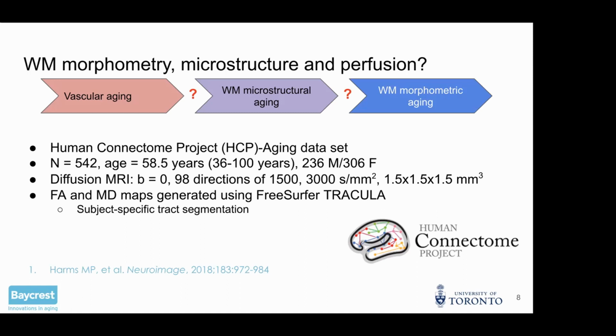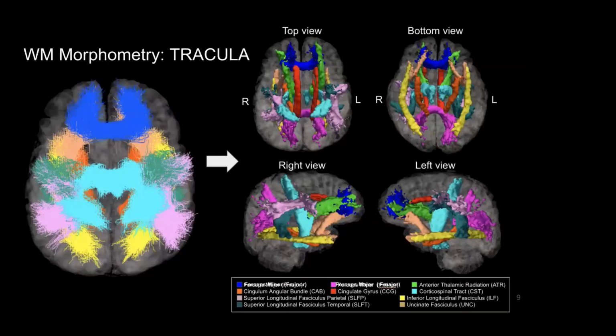So that's right. We're focusing on analyzing these not by white matter regions, but the actual known tracts. And so how TRACULA works, very briefly: within each subject, these streamlines are generated and then they're pruned to give us this native space set of segmentations for these well-known tracts.